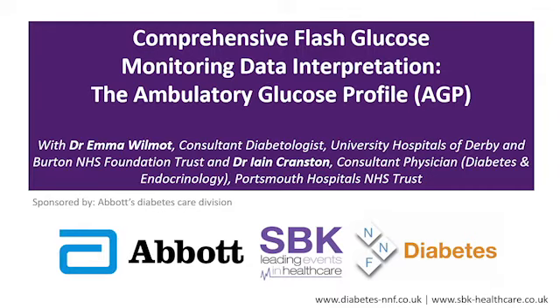I think one of the cases that I was showing was somebody who had 69% in target range, but actually had quite a high percentage below range. So we literally had someone saying, oh, well, that time in range isn't bad, but of course it could be better. We're saying, no, that time in range is actually at target. What's not at target is his time below range. So that's the thing we should be concentrating on.